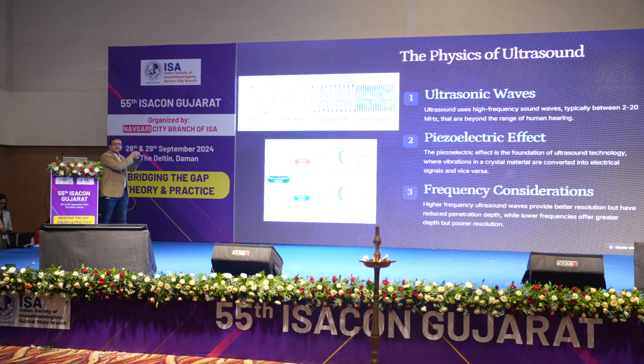In the ultrasonography machine, an electric current passes and reaches the probe. In the probe there is a piezoelectric material. That electric current generates mechanical energy, vibration, in the probe, and it generates the sound wave. So here it is a reverse piezoelectric effect. That sound wave hits the object or subject, comes back and again hits the piezoelectric material, and it generates an electrical current. So that is the piezoelectric effect. So initially the reverse piezoelectric effect and then the piezoelectric effect generate some view on our screen.